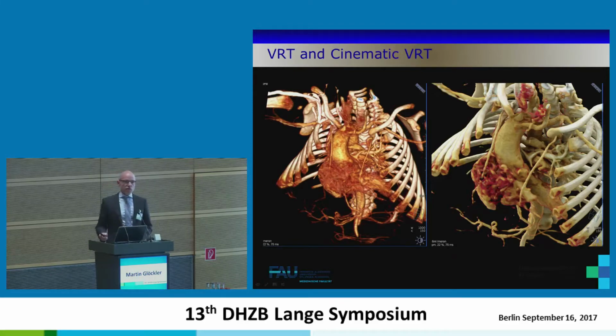The workhorse of 3D imaging is the volume rendering technique. This appears with only one or several clicks in the 3D machines. We can see this patient with a pulmonary atresia and VSD. The original data set is a CT, and for example, we can visualize the central pulmonary artery in nearly every patient.